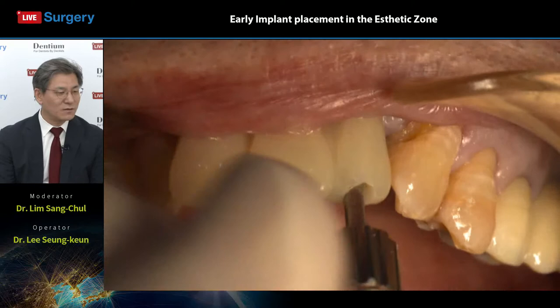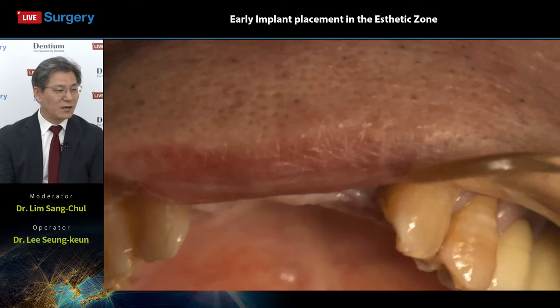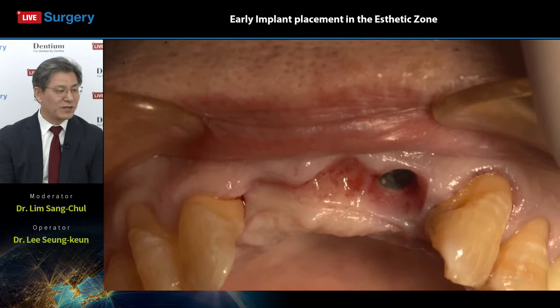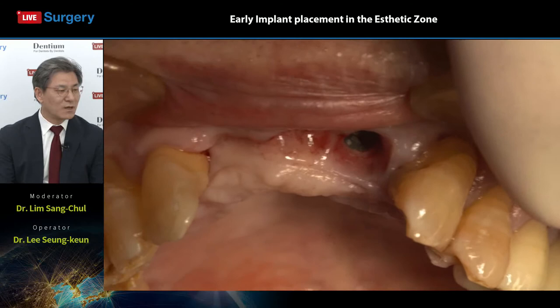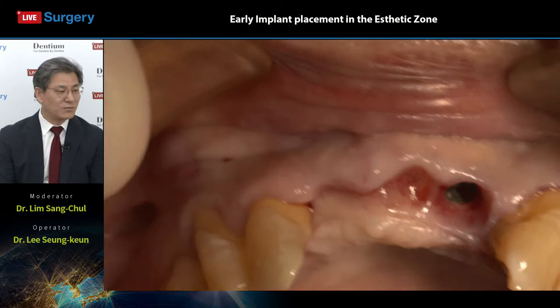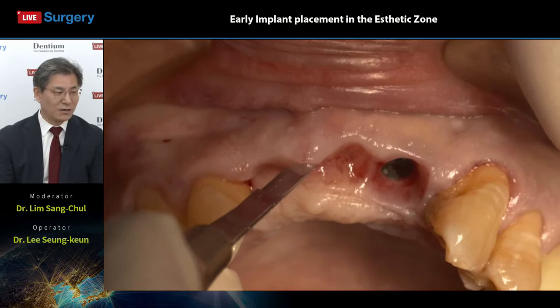So, okay, now he has removed the screw with a screwdriver, removing the temporization to prepare for the anterior implantation surgery. So, I already mentioned this soft tissue healing site. Slightly, yeah, as you can see, the number 21 area has some depression, but it is not too bad, because these areas will be the pontic area, right?